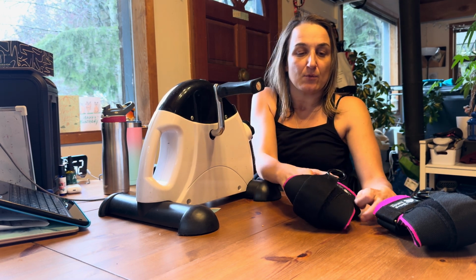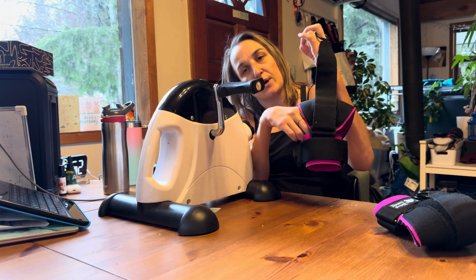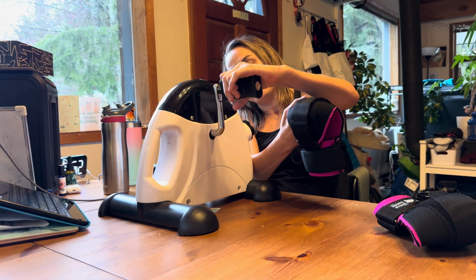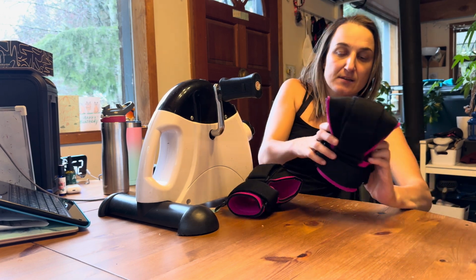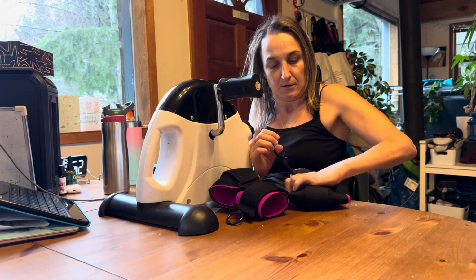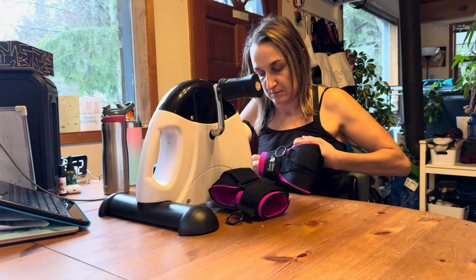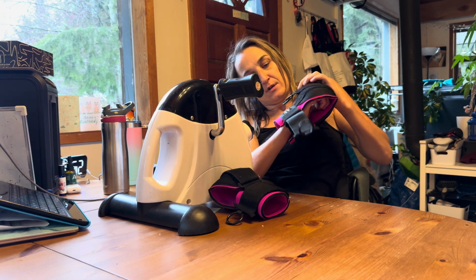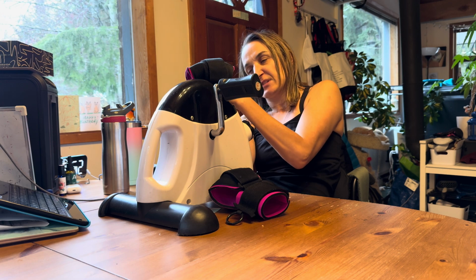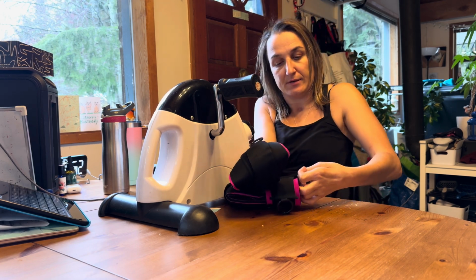So the first thing would be to, if it's not already cupped and stuff, I would set it up so it's loose enough that you're going to be cupping the hand and fitting it around the handle, and do this on both sides. They're both done on each side, and then you put your wrist in. So opening up the wrist, making sure that you're putting the right hand on the right and then the left on the left. And as far as hand holders, I found the active hands are the ones that work the best, but you can get some especially made for you as well at your spinal cord injury rehab place or wherever else.